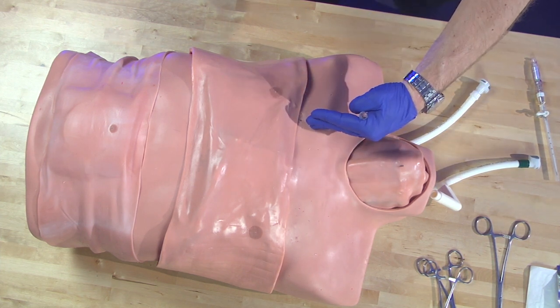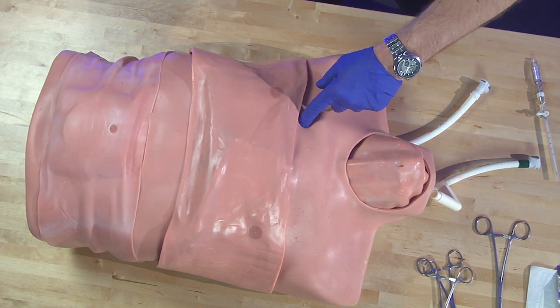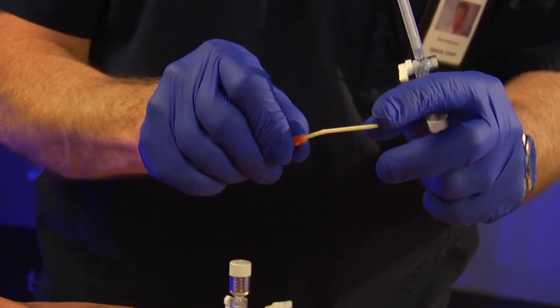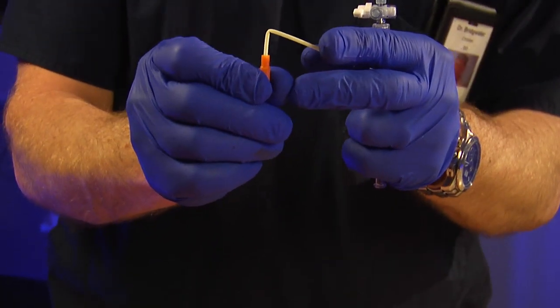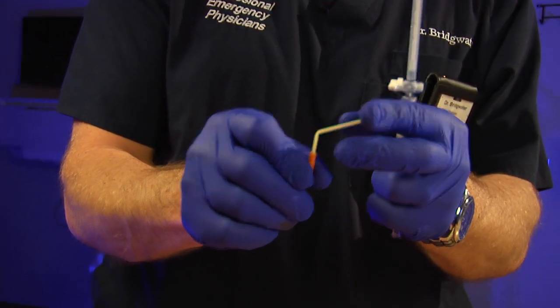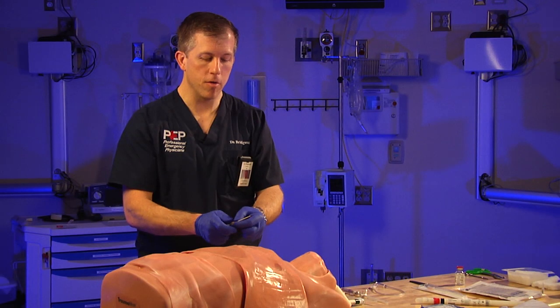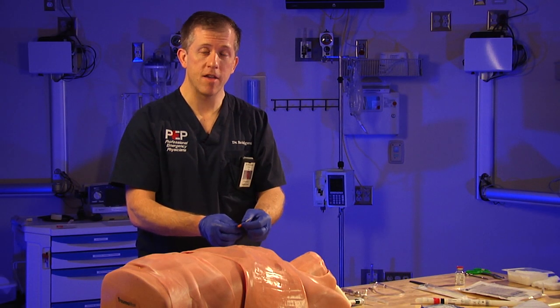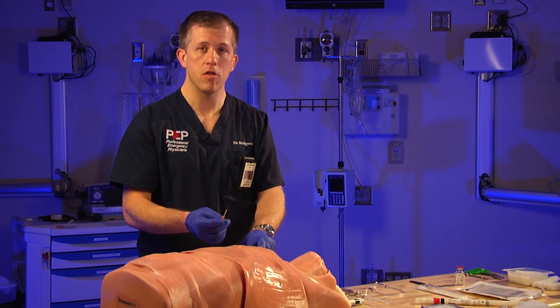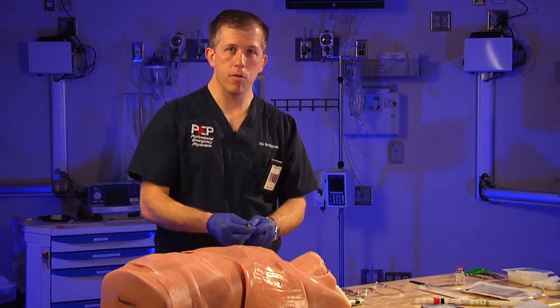Here's the patient's clavicle. You go right to the mid-clavicular line, right below the clavicle, find the second intercostal space, and use the old traditional angiocath. The problem with angiocaths is they very easily kink — once kinked, they're of no use. They're also relatively short, only a couple centimeters. With the typical size of patients today, it's very difficult to get this catheter through all the soft tissue to actually reach the pleural cavity and perform decompression. There were a lot of failures with this old method.